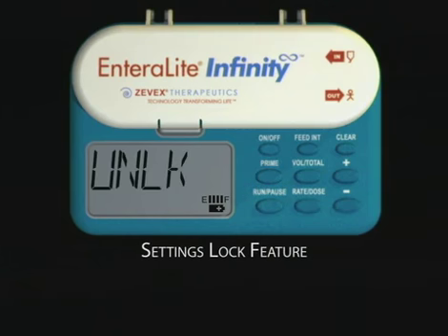The other user preference settings are accessed by pressing the prime key. Press the prime key once to access the settings lock feature. The display will show an abbreviation for unlocked or for locked. Press the plus key to change to locked or the minus key to change to unlocked. When locked, the rate, dose, and feed interval settings cannot be changed.